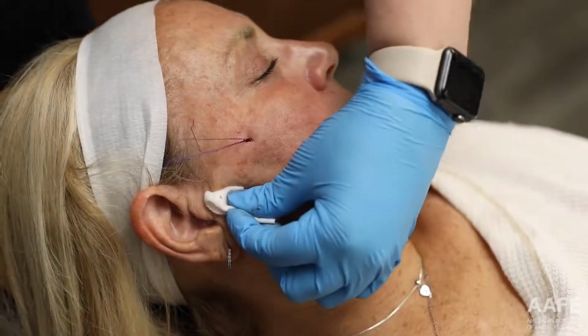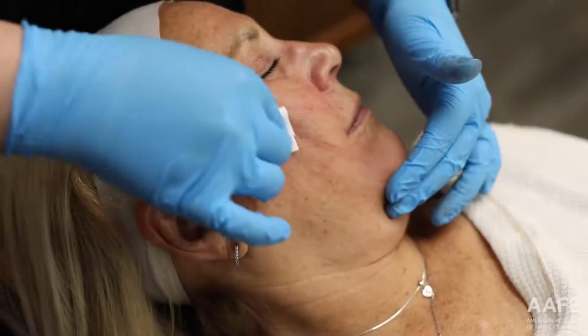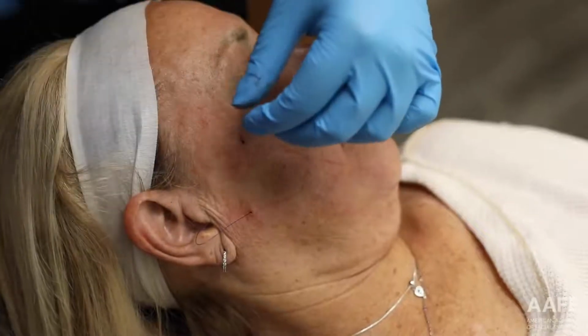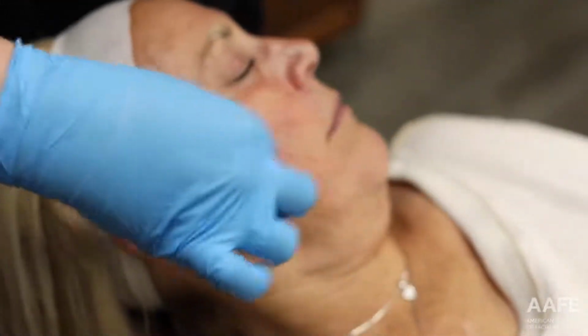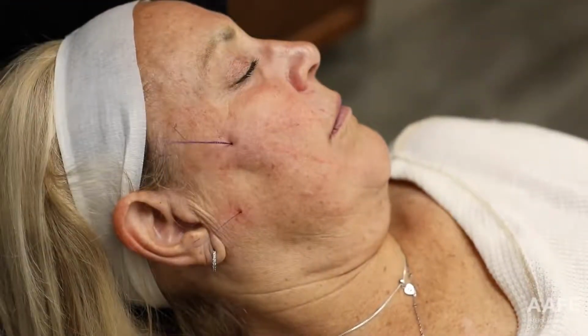Okay, so we have the jawline and her 3 vectors. So now what I'm gonna do is sit her up before I trim, because once you trim, you can't go back in. So I'm gonna sit her up before I trim and see what kind of result I got, and see if I want maybe one more to the jowl or one more to the jawline. So let's go ahead and do that.